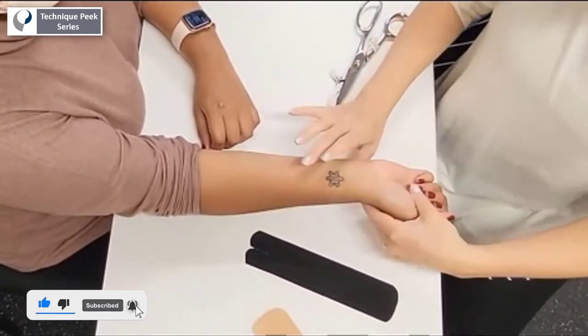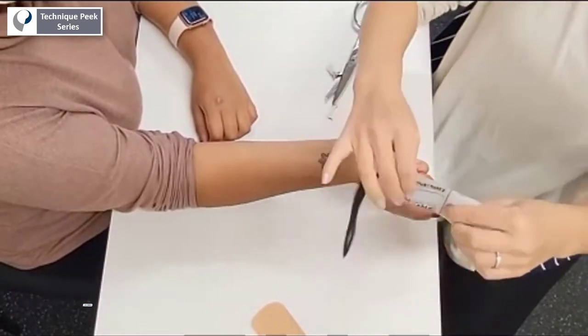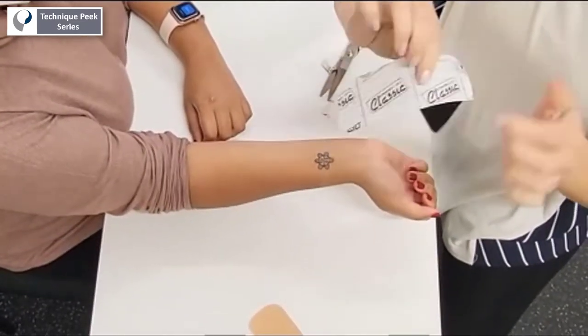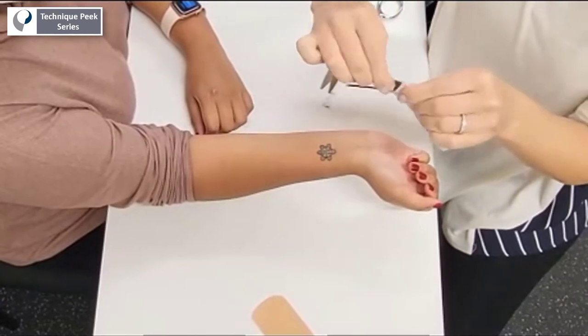Prior to application, be sure to cleanse the skin with rubbing alcohol. Tear your piece one and a half squares from the base and at the end of each tail.